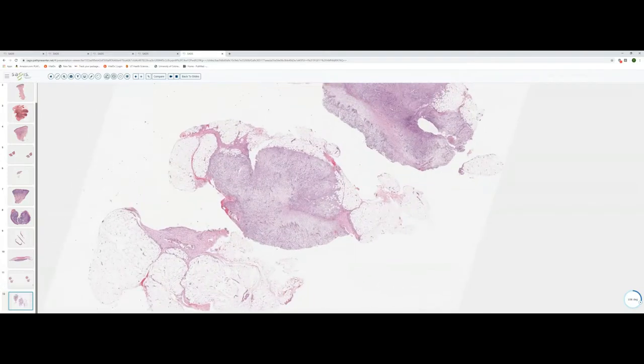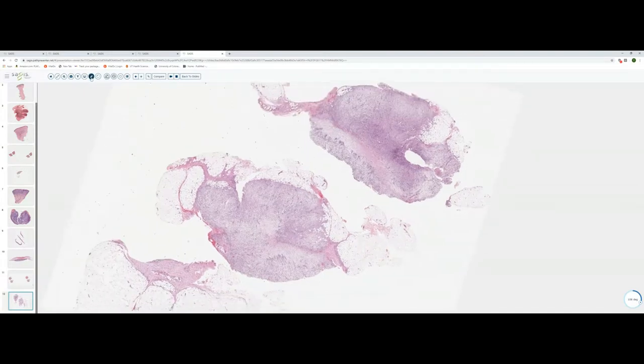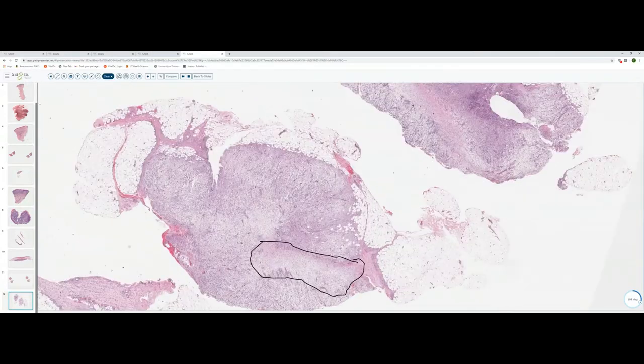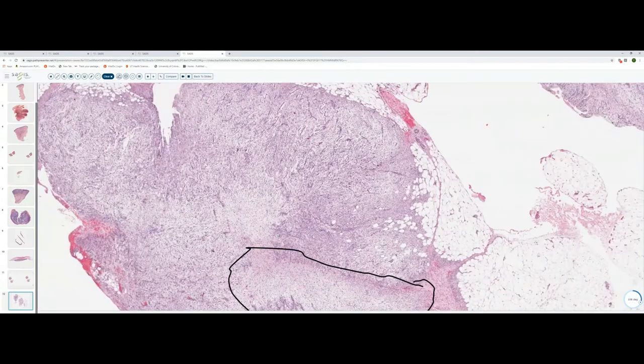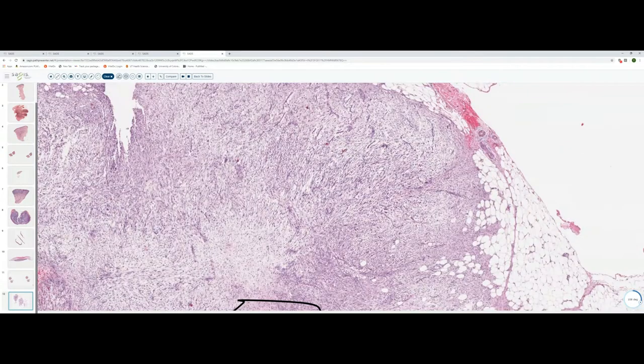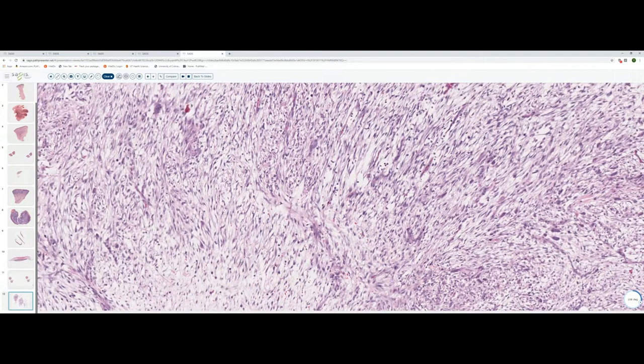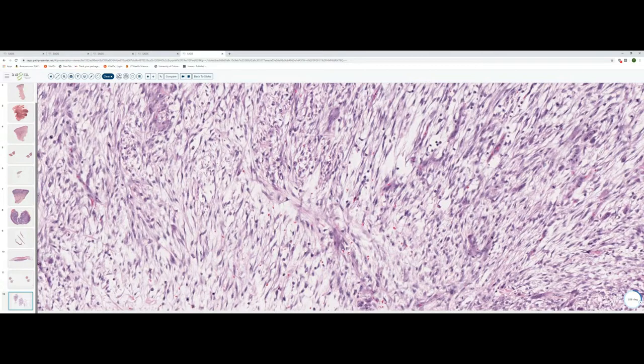And one can appreciate even at scanning magnification, there are both hypo and hypercellular areas. And then if we move to higher power, we can see embedded within an extremely myxoid stroma, a proliferation of uniform spindle cells. Now, some of these are kind of plump and stellate with prominent nuclei. There are a few mitotic figures, but they're normal in appearance.